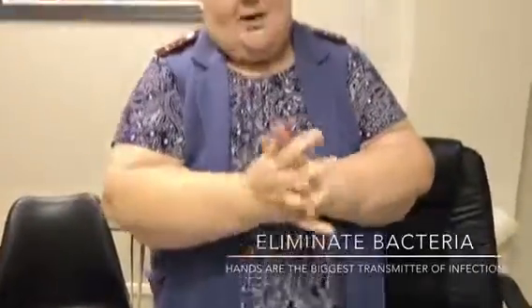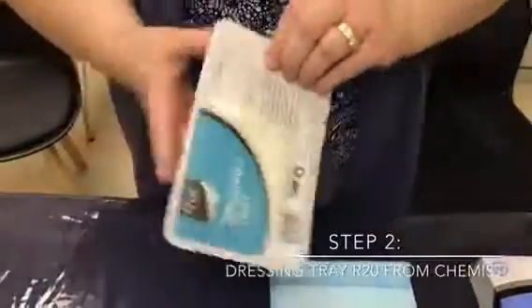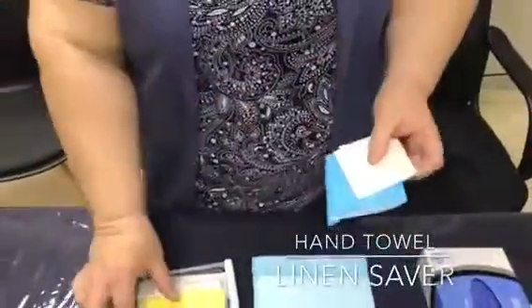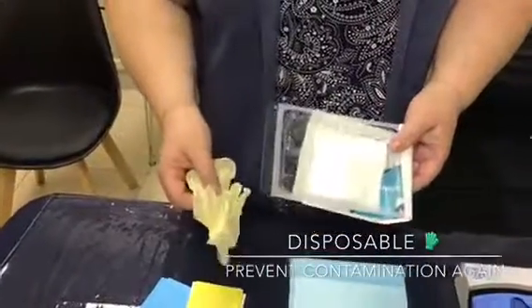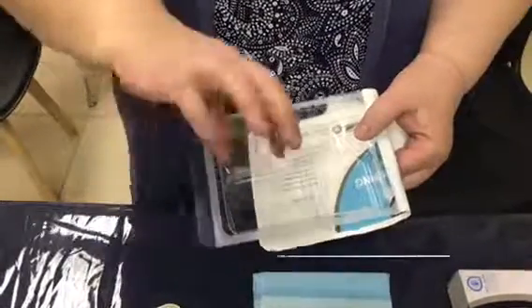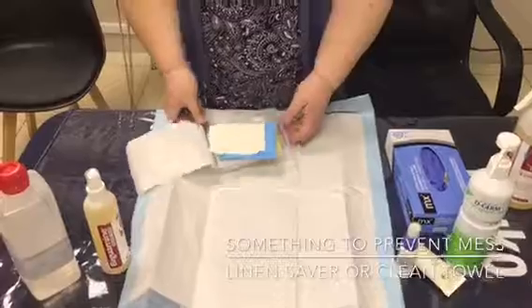The hands are the biggest transmitter of infection. The second thing we have is a dressing tray, which assists us a lot. Inside the dressing tray you'll have hand towels, a linen saver, a bag which goes into a red bag, your disposable gloves, some gauze, and a little bowl to put your wound cleaning solutions in. It's also important to have a linen saver so that you don't mess on the patient.